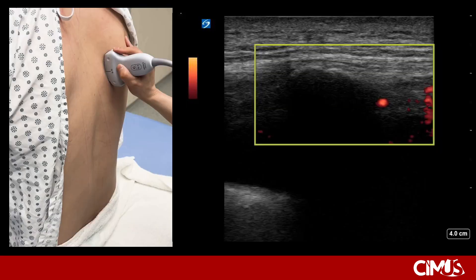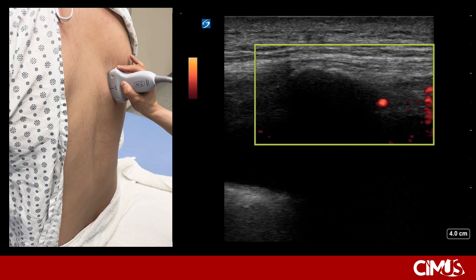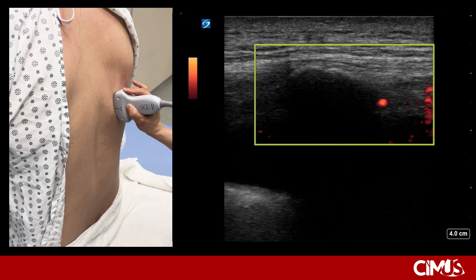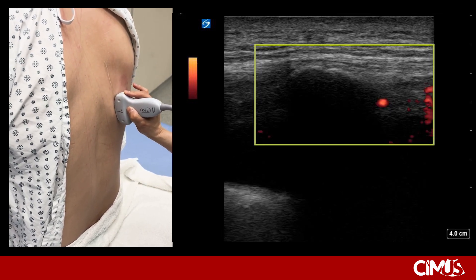When evaluating a pleural effusion in a longitudinal plane, at least 10 centimeters laterally from the spine, with the transducer marker pointed cranially, slide the transducer inferiorly down the posterior chest. Once an adequate fluid collection is identified, the probe should then be exchanged for a high-frequency linear transducer to identify the intercostal vessels.